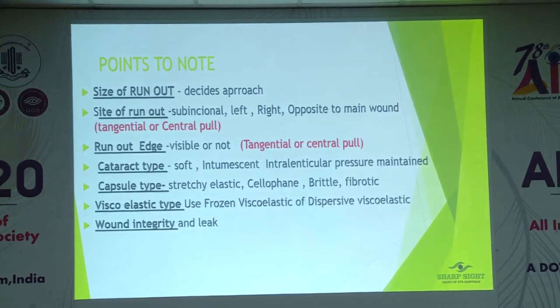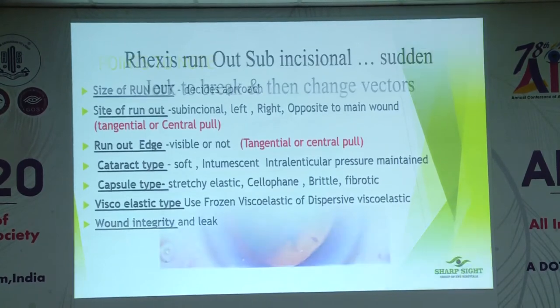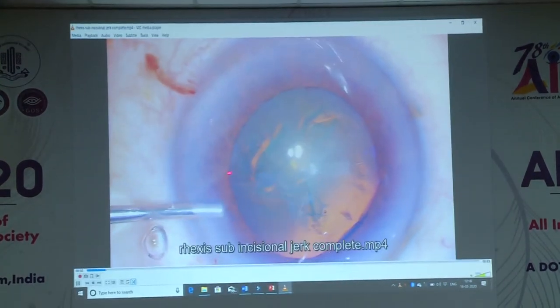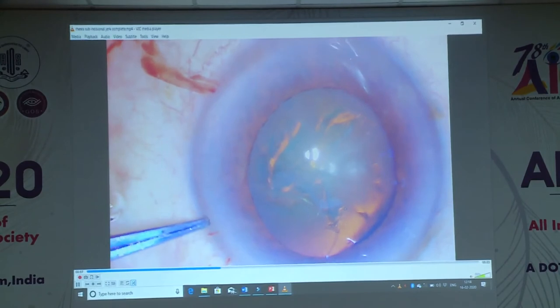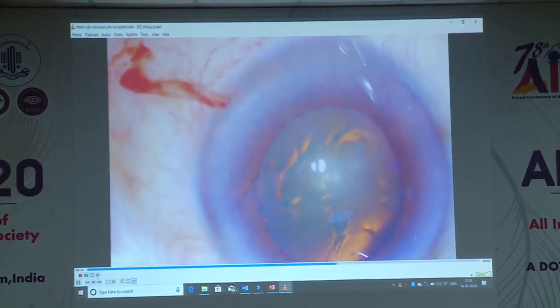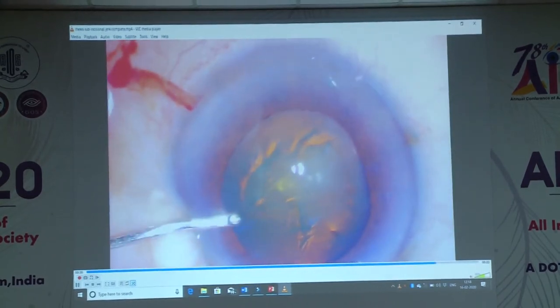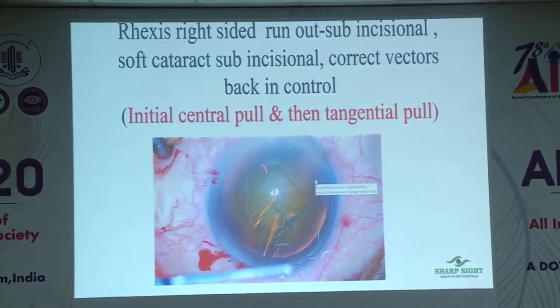Points to note: size of runout, site of runout, edge — whether it is visible or not — capsule type, and cataract type. All these things will decide management. Now in this first video, the capsule rhexis has actually run out sub-incisionally. What I did: first I pushed in viscoelastic, I flattened the capsule, and then with one jerk — one radial force and one tangential force — it comes back. It has to be done with a jerk. If you go slowly it will catch another zonule and go out. Hold it, push it firmly, and then apply a tangential force to stay in the safe zone.